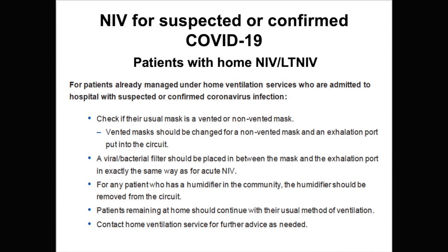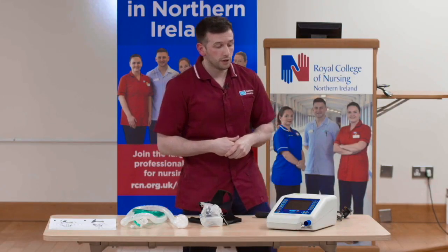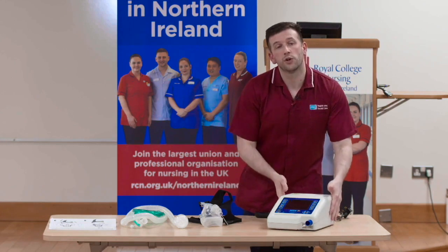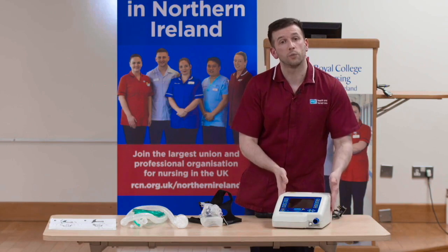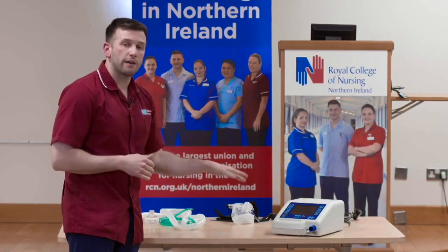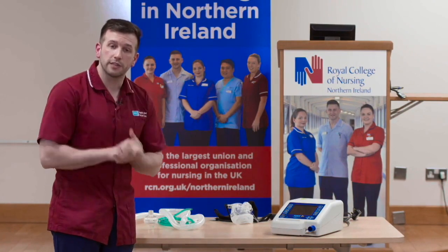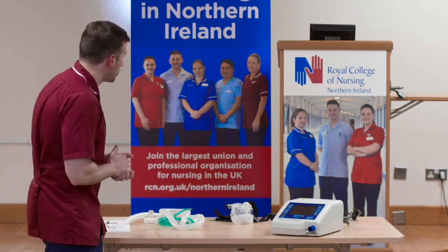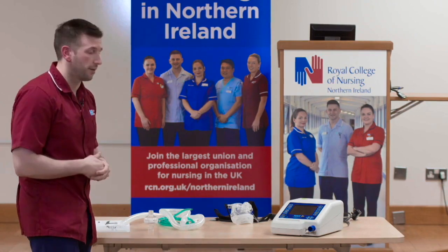Next, I'd like to talk to you about the setup of this therapy. You'll see the components in front of me, which I'm now going to describe to you. First of all, you need to locate your non-invasive ventilator. And this is an example of a common non-invasive ventilator that we would use here. Once you have your non-invasive ventilator, you're going to need to locate the appropriate interface for your patient to use, and also you're going to need an NIV circuit in order to deliver the therapy.